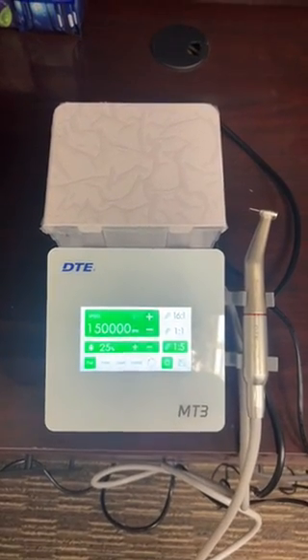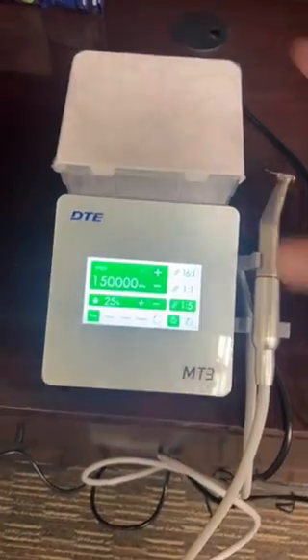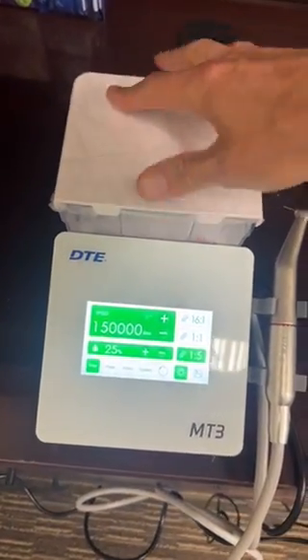This is the MT3. It is pretty straightforward, so let me show you really quick. Here's where you're going to put your water — just a water tank here.